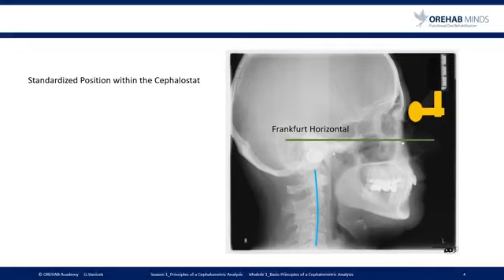In addition, we have an element which supports the patient to maintain this position. This is the glabellar support, anterior here. And the patient is stabilized also with 2 parts which are in the meatus of the right and the left side of the patient. So in this position, the spine is quite relaxed and the head is more or less in a natural position.